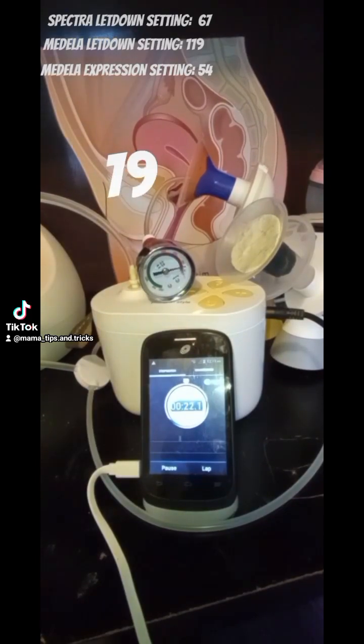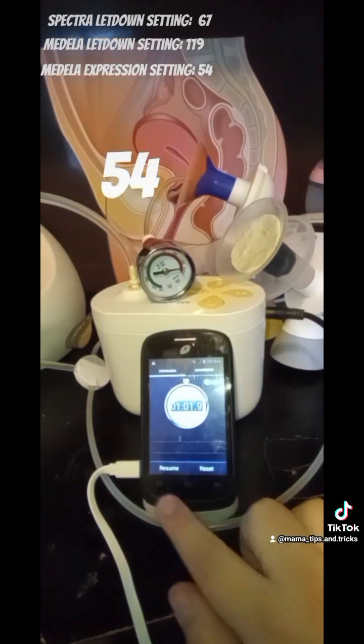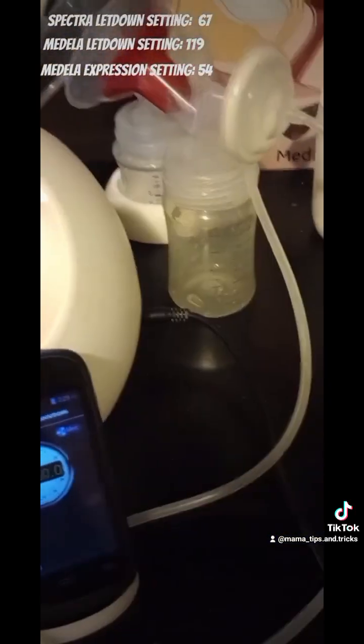And the last huge difference between Medela and Spectra is how long they last. Okay, if you tip your Medela on its side, it loses suction within like 60 seconds, even if it's not running. If you put it on its side, the oil in the motor runs up into the vacuum chamber and it will actually plug the valves in there that hold the suction, so it loses a lot of the suction.